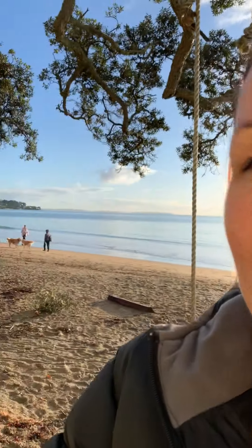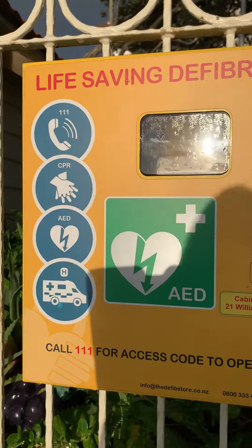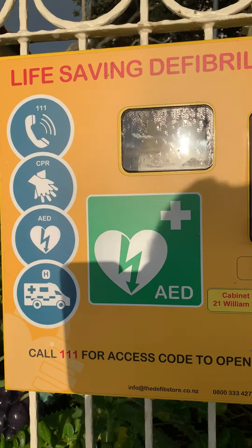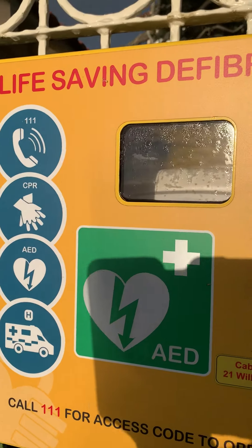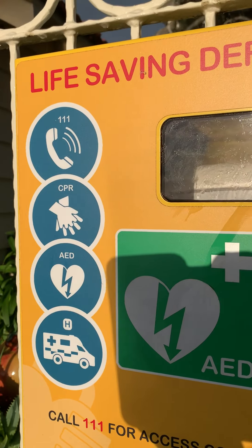Hey, it's Kate from the Defib Store down on the beautiful Takapuna Beach on a winter morning. We're checking one of our first community install cabinets, which one of the residents of Takapuna has donated to the community. This one has been here for three years — I thought there was moisture inside but it's just the morning dew.